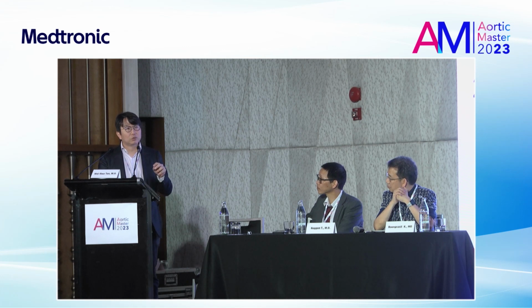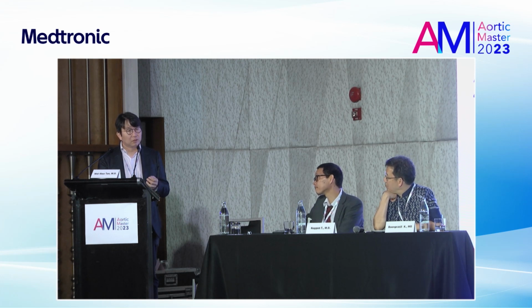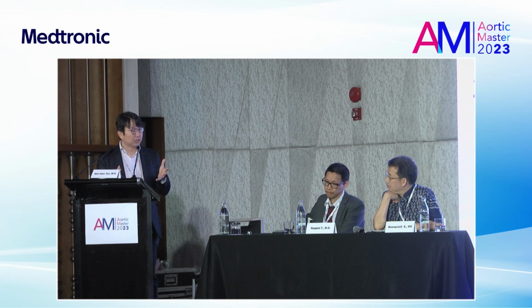When you do that, and when you do the angio and you find that the flow slows down very quickly, then you know that you might be very successful. So we only use a candy plug, or we use some Excluder, if we have a very large false lumen in those cases.